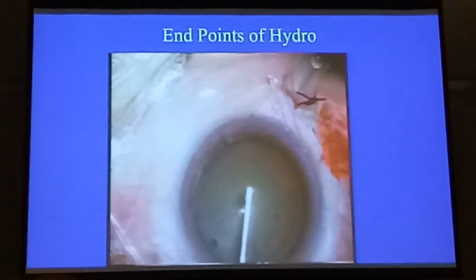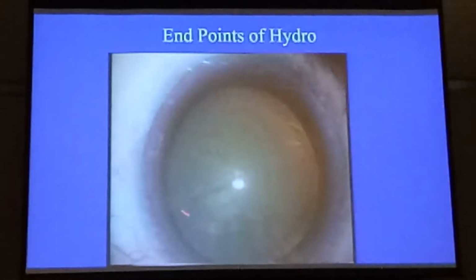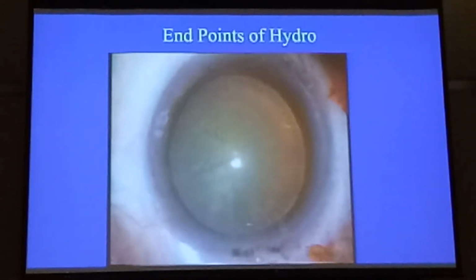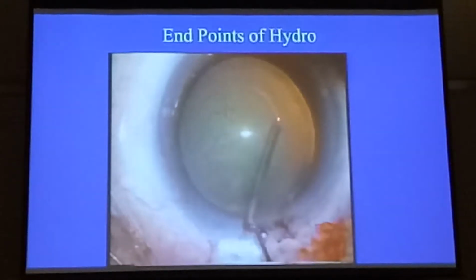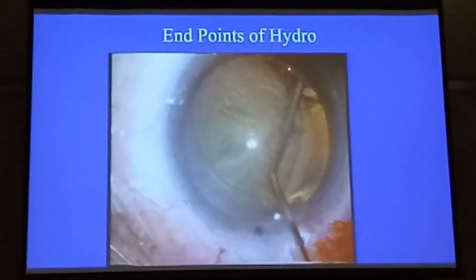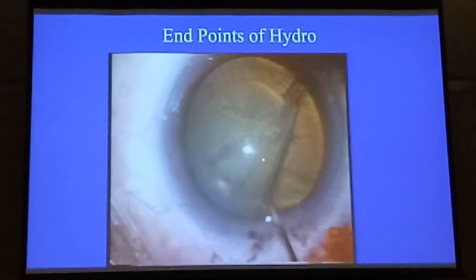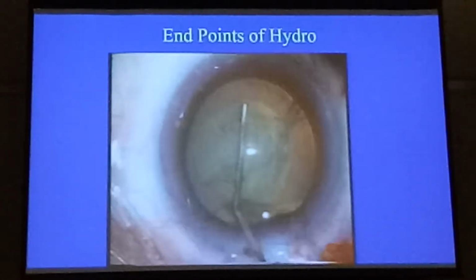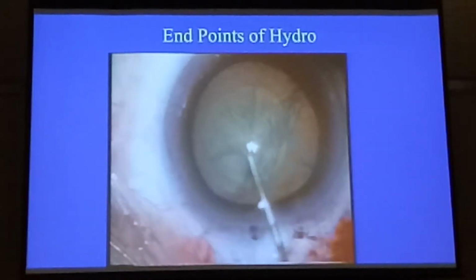So let's look at one of these cases here. There's the CCC there, not a very big CCC. Remember, when you bring your cannula in, some people like a flattened cannula, about 25 gauge, look for the edge of the CCC, lift it up and inject. Just watch very quickly, you'll see that's the wave, that's the lift. Okay, those are two signs. And this is another sign, pushback. You see the nucleus pops back in. Very useful sign as well.